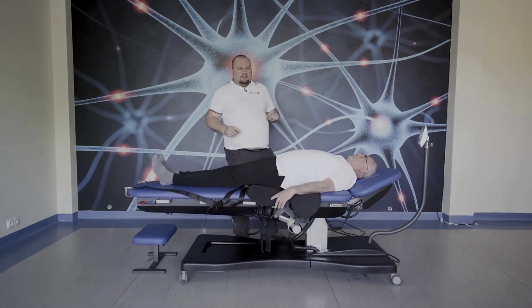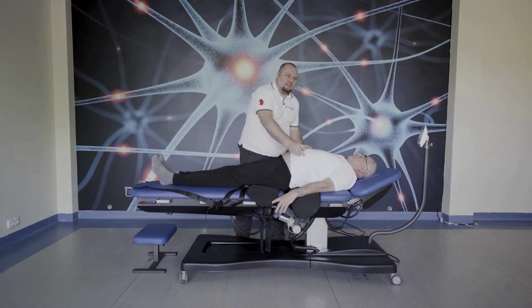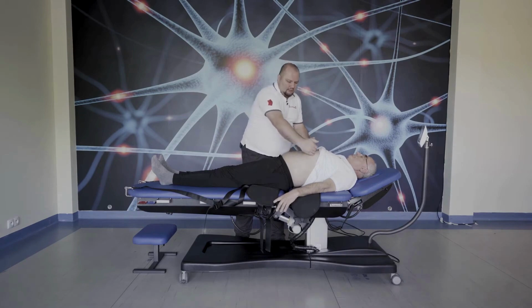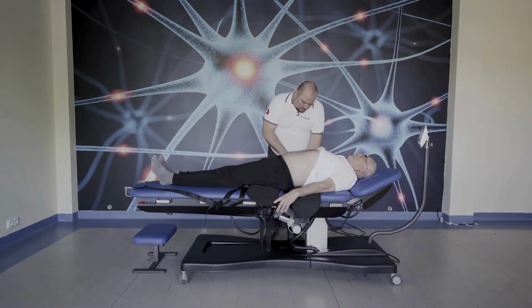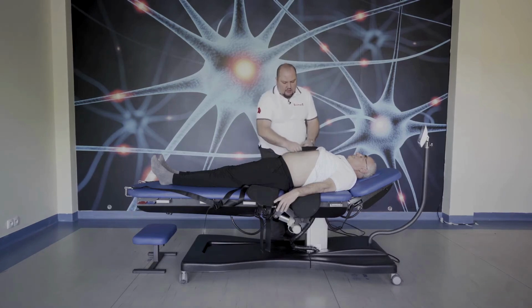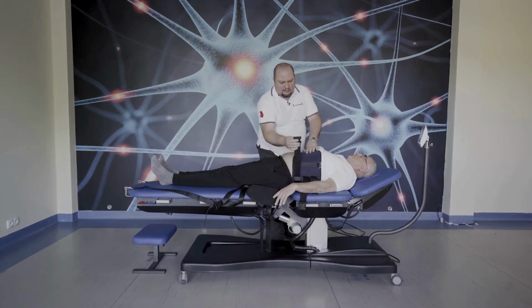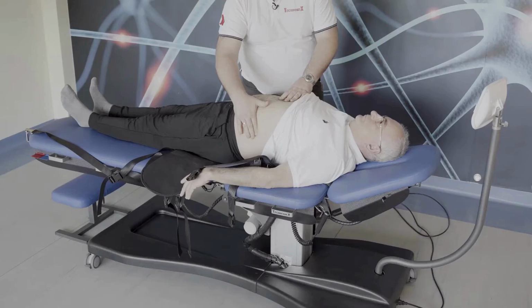We do not need to uncover patients completely, but we must have skin below the ribs and the pelvis. So when we have uncovered the patient, we put the thoracic part in such a way that the lower strip of the thoracic belt is below the ribs.